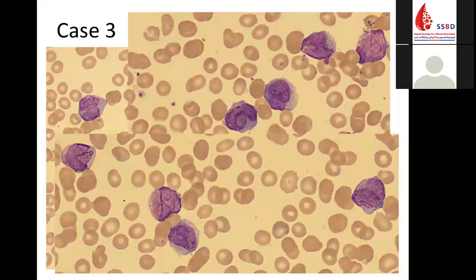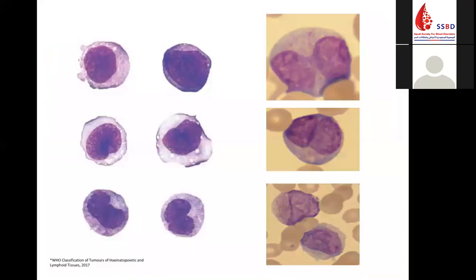However, it's very challenging sometimes. It wouldn't be easy like this one, and these cases could be confused with cases of acute myelomonocytic and acute monocytic leukemia because of the similar morphology of the cells. And this is the famous picture from the WHO showing us the monoblasts, promonocytes, which are blast equivalents, and abnormal monocytes. And I put here our patient's microgranular or hypogranular abnormal promyelocytes. And I would understand if any junior resident or fellow or whoever would miss or confuse between the two.